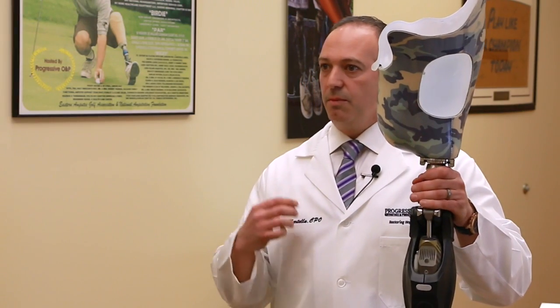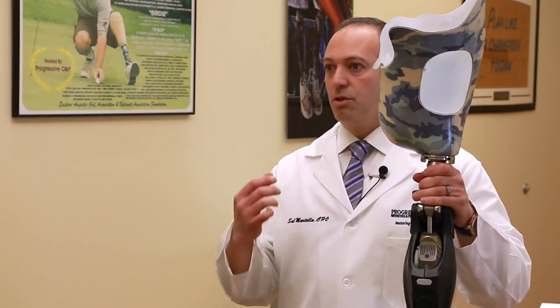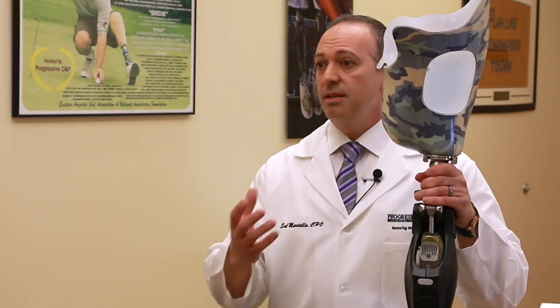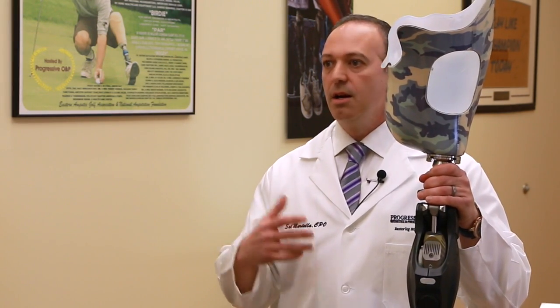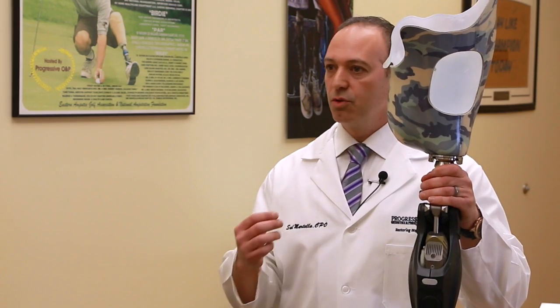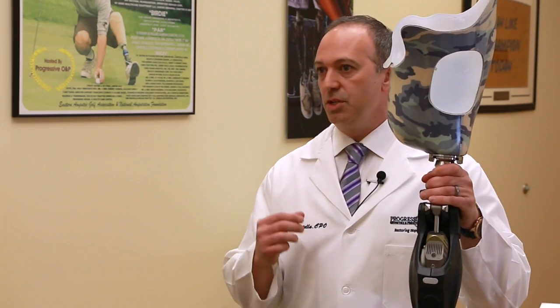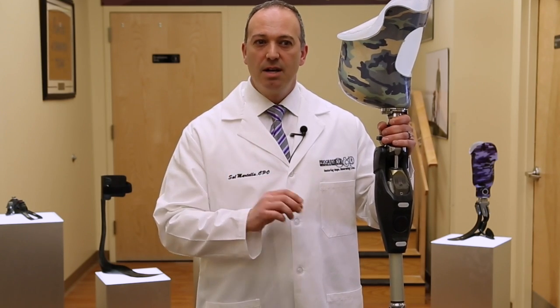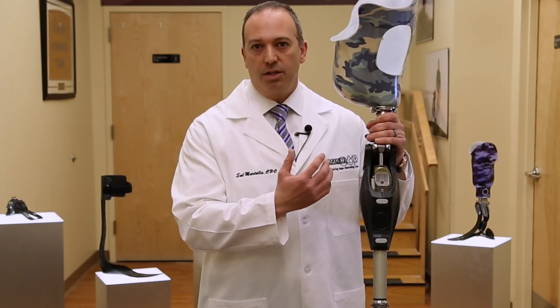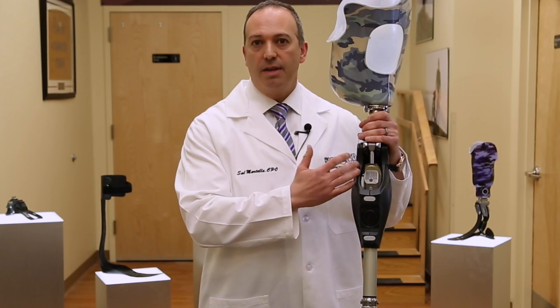If you have any questions, it would be a great idea to do a demo and apply it to either your existing socket, or if you're having a new prosthesis fabricated, apply it to that socket so you can truly see the benefits of the Genium. The Genium also takes about 38 steps to program, and all of our clinicians are certified to do that programming and provide this device.